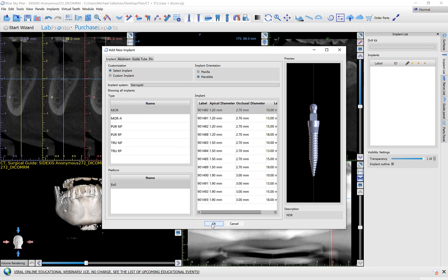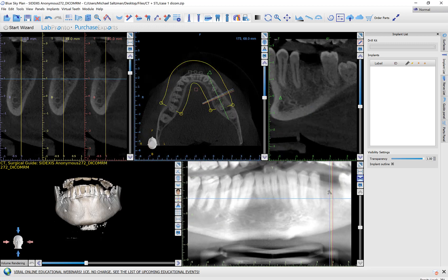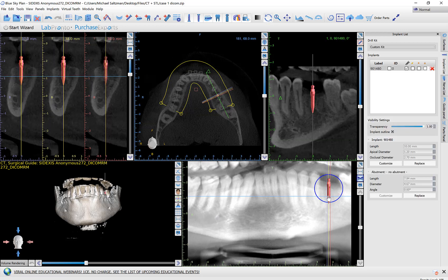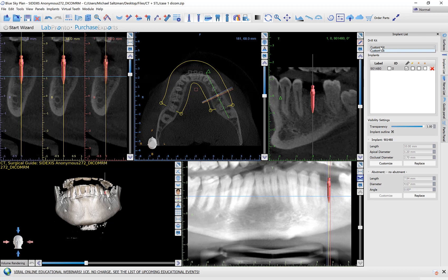If I go ahead and select an implant and randomly drop it in, now I am limited to the relevant drill kits. If there are no relevant drill kits in the software for this implant, then the option will go to custom kit automatically.